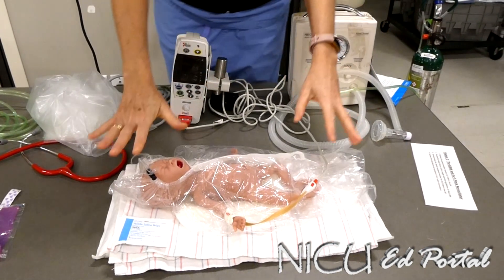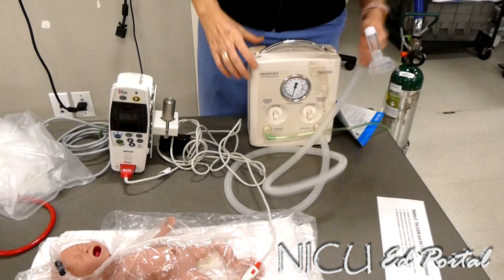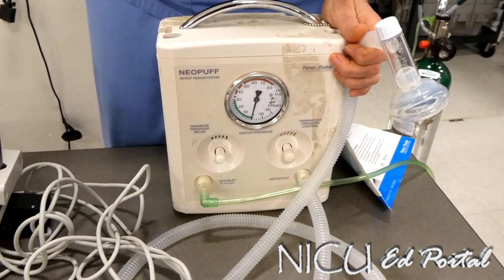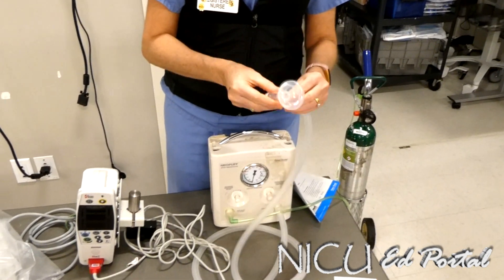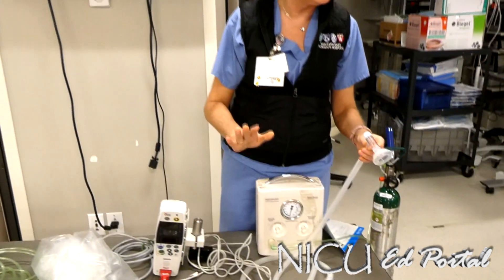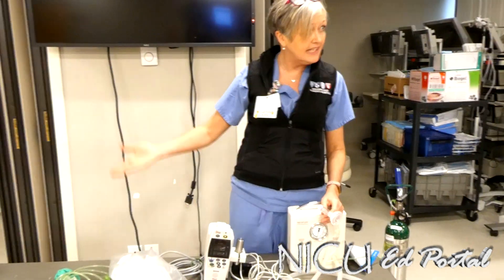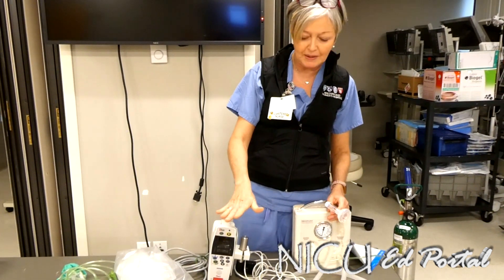Let's also look at the Neopuff — we refer to it as the Neopuff because that's the brand name, but when you did your NRP you read about the T-piece connector. There's my T — it's my T-piece connector. With the introduction of this device, we have saved so many babies from getting pneumothorax. When the initial resuscitation happens, we'll have our bag hooked up to the normal pressures and set at 21% room air, because all babies get resuscitated at 21%.